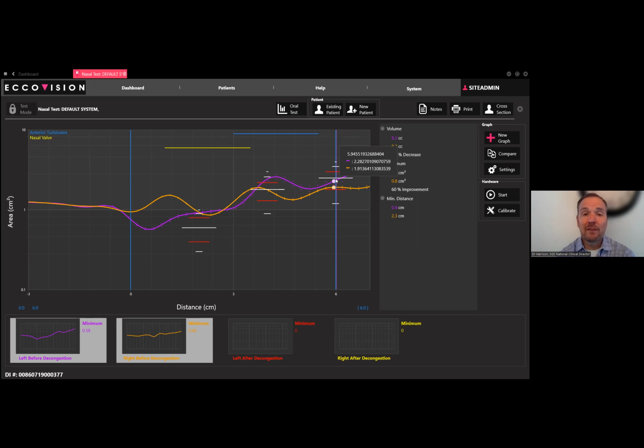Also, if we have a small nasal valve, I'll have them do it. My nasal valve's above average, but I have a very collapsible nasal valve. I actually wear a dilating strip. Dilator, yeah. And that's something we look at, nasal valve collapse, during our evaluation.